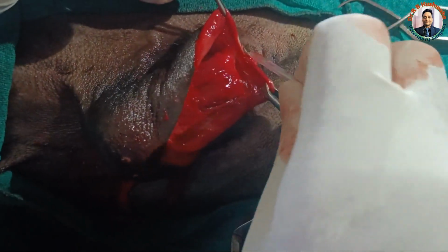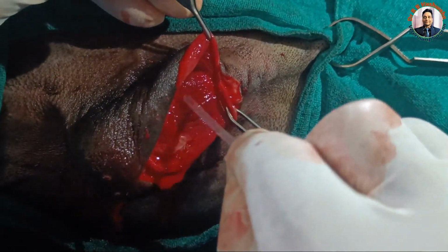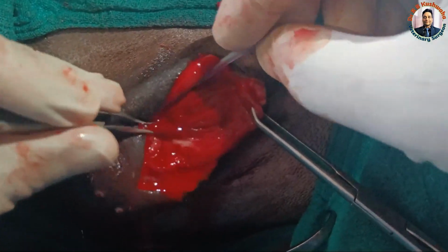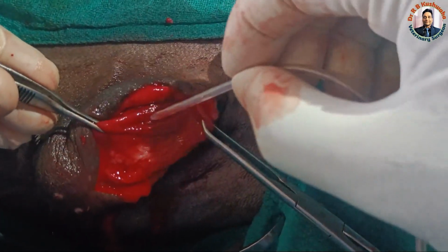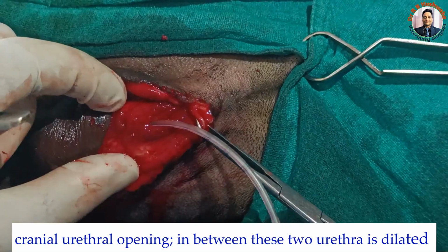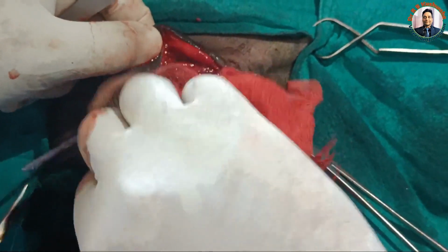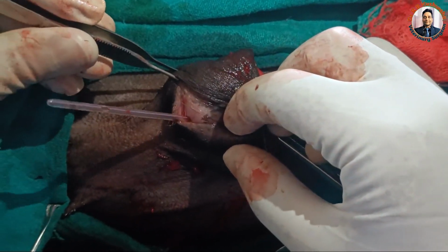from here, this is the caudal one, and if you see here, there is a mild groove-like structure here, and if you pass the catheter from here, it will go like this. Now you could see this catheter is going, and it emerges out from this prepuce.